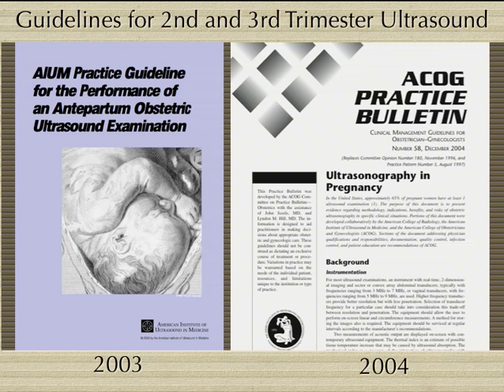In 2003 and 2004, the American Institute of Ultrasound in Medicine, the American College of Radiology, and the American College of Obstetricians and Gynecologists published identical documents detailing the components of the ultrasound examination of the fetus. These documents have become the standard by which the legal community determines if a breach of care has occurred when a misdiagnosis is identified following birth. Although these documents contain a number of recommendations, let's focus on the examination of the fetal heart.